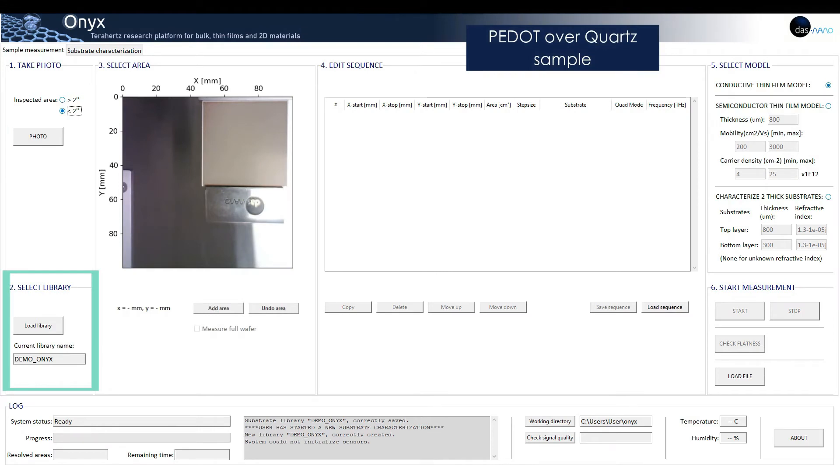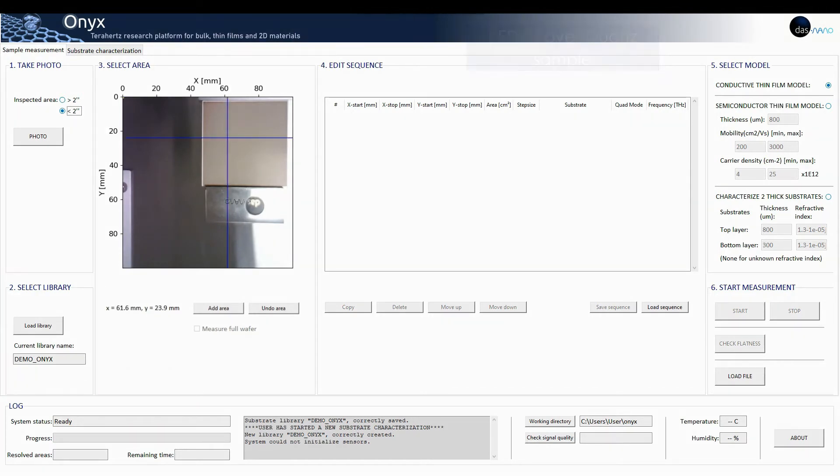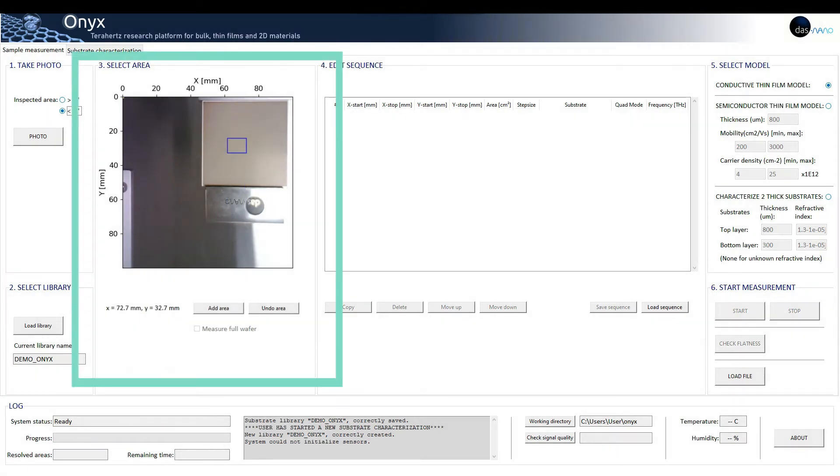If we want to use a pre-characterized substrate, the user should load the desired library.